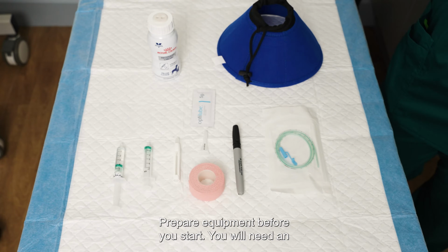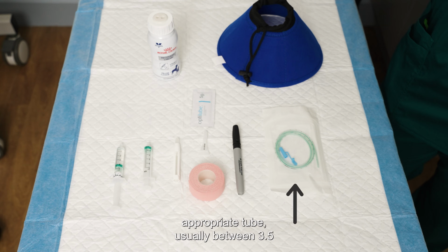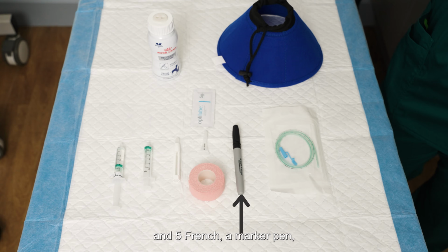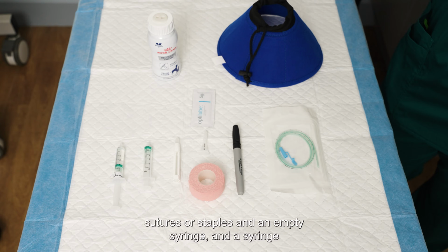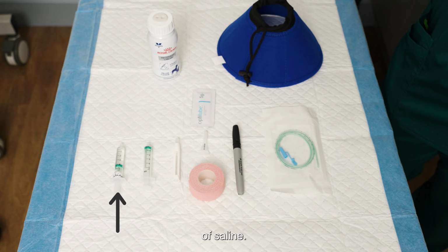Prepare equipment before you start. You will need an appropriate tube, usually between 3.5 and 5 French, a marker pen, tape, local anaesthetic drops such as proxymetacaine, glue, sutures or staples, and an empty syringe, and a syringe of saline. Appropriate sedation may be needed.